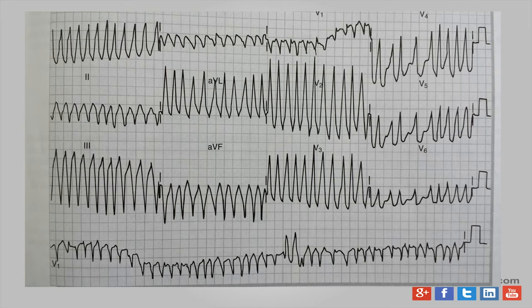Now, this is not a cardiac emergency right now, but they're pretty fast. If you want to slow them down, you have to be very, very careful with what you slow them down with. When you have an accessory pathway somewhere out in the left lateral wall of the left ventricle, let's say you give them esmolol or adenosine or any AV nodal blocking agent, Cardizem, you block their AV node, that pathway is so fast, as you can tell from here, and it's capable of conducting at 300 beats per minute or more. This patient can easily go 300 beats per minute, decompensate, have hemodynamic collapse, go into V-fib or something else, and go into real torsades. And then this patient needs to be coded in ACLS protocol.